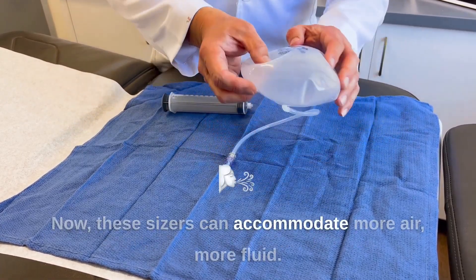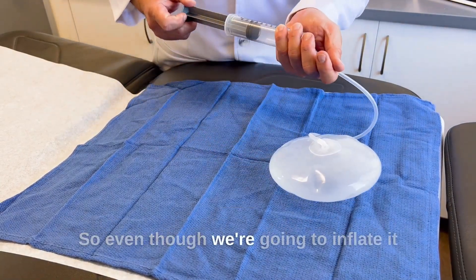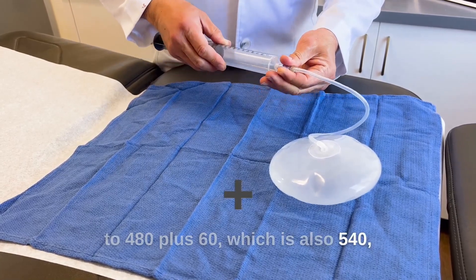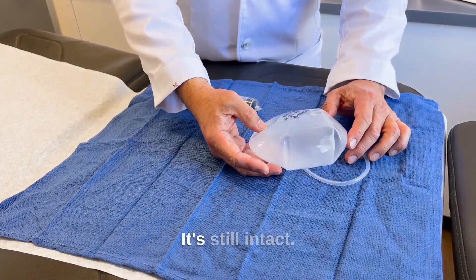Now, these sizers can accommodate more air or more fluid — the envelope is slightly stretchy. So even though we're going to inflate it to 480 plus 60, which is 540, technically bigger than 500 — no explosion. It's still intact.